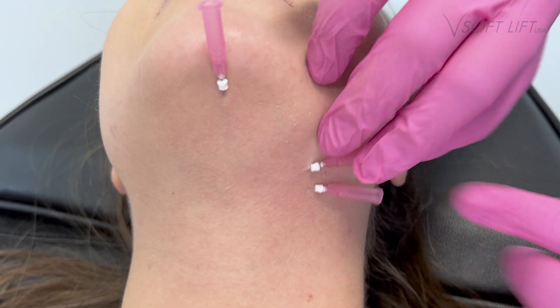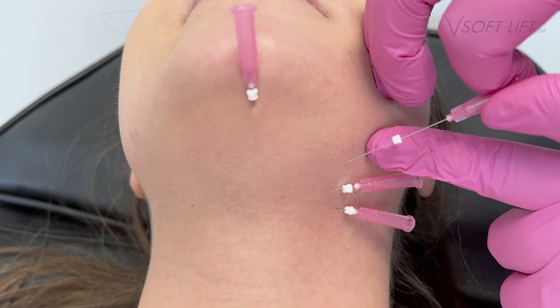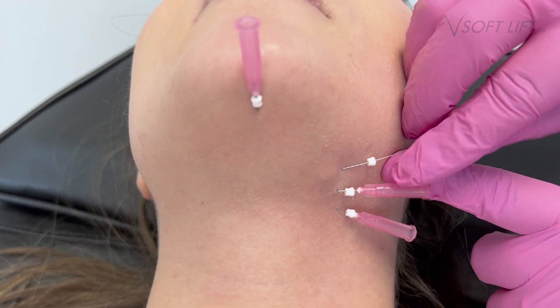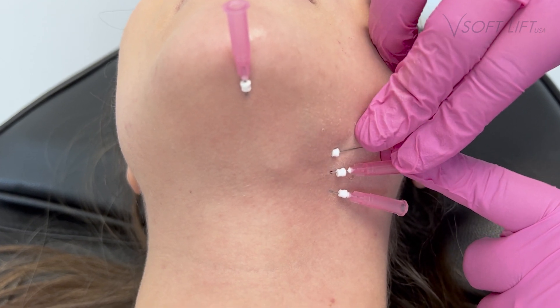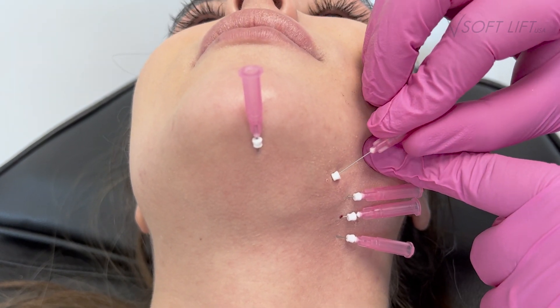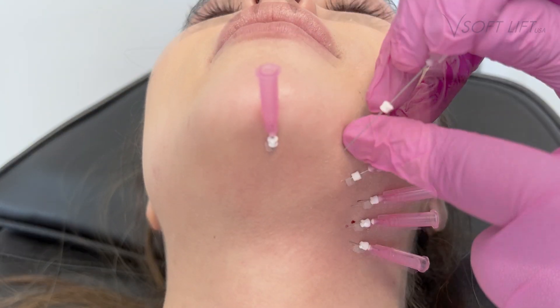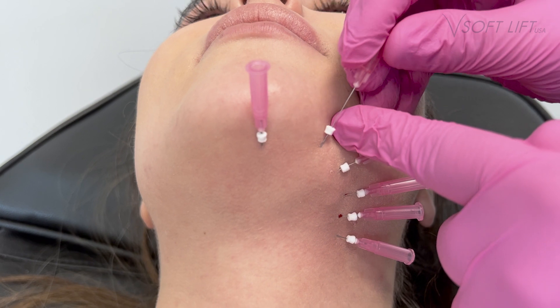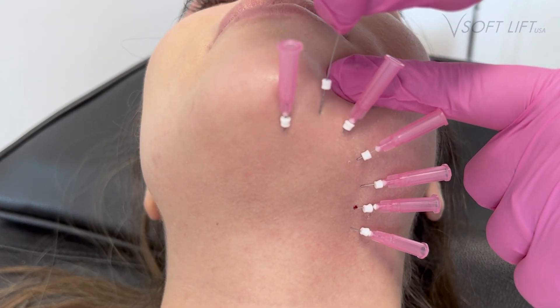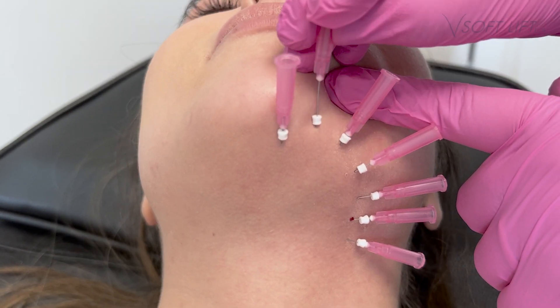We're treating the submental area, and this patient is really looking to target this area, tighten the tissue, and create a more defined jawline. I am placing these threads in what I call a sunset pattern, just evenly across my treatment area. My thread of choice today was the VSoftLift Twisted Smooth Reds — this is a 29 gauge by 40 millimeter thread.